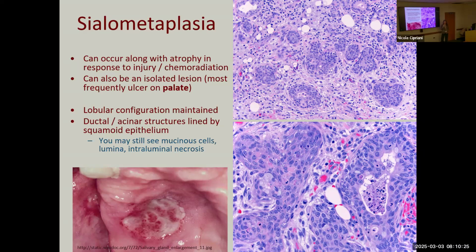Unlike squamous cell carcinoma, which is the mimic of this, you usually have pretty rounded nests because these are still within the confines of the acini, rather than highly angulated, infiltrative, very pleomorphic looking squamous nests. So this can be tough, especially on a frozen, if you're dealing with a treated case, but always look for the residual acini, the residual mucus cells, or the residual ductal lumina.